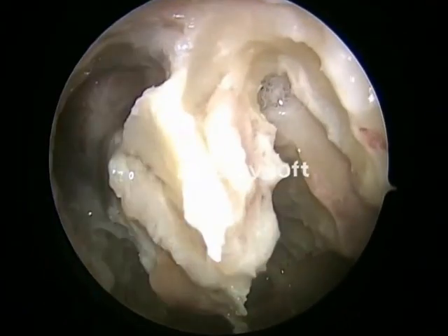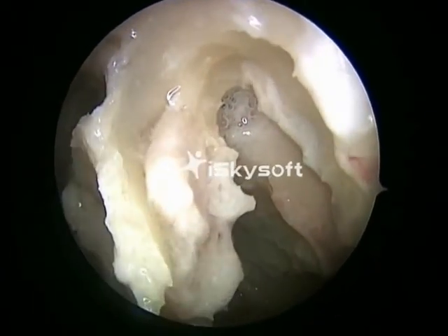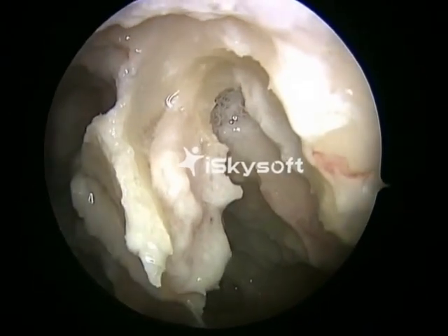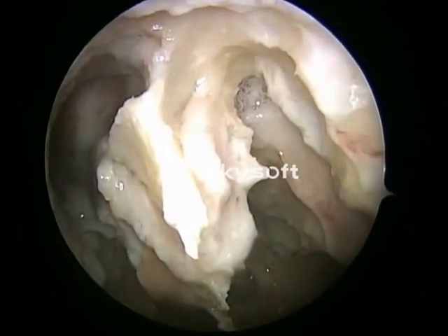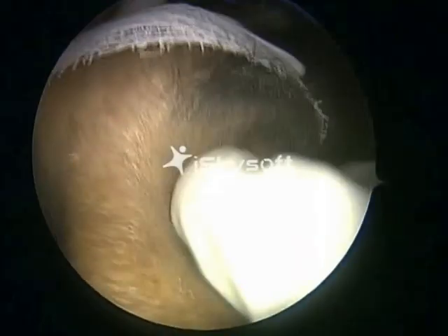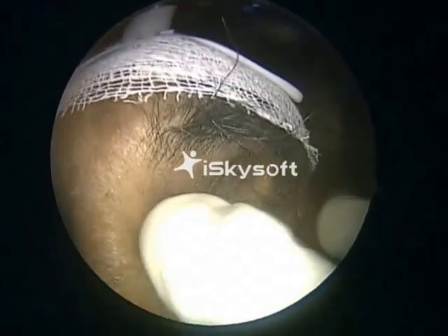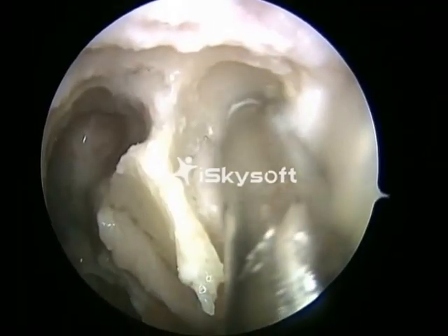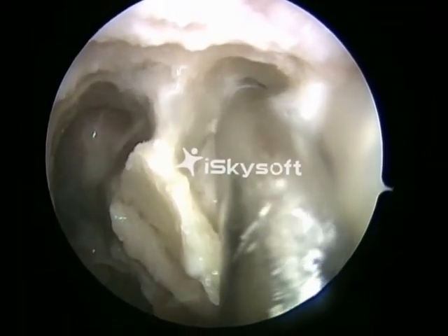You can see the skin there very clearly. That's the skin. On external compression, you can see it moving there. That forms the lateral limit. That's external compression being done. And now we turn medially.